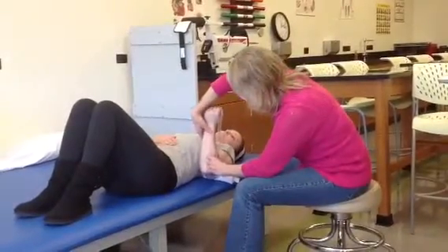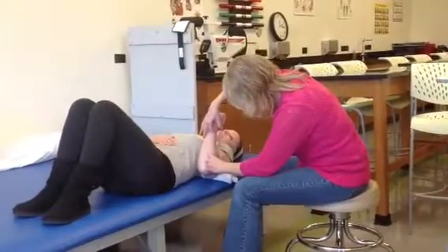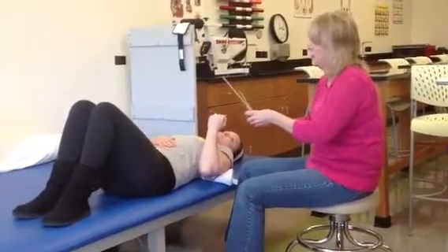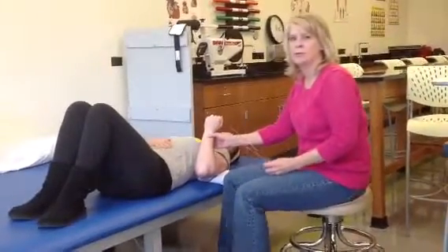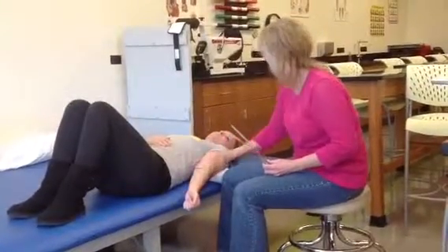and so we're just going to go ahead and take a hold of her arm and just move it down a little bit more to where she is, about right there, and move it down. And at this point, she's at about 130. So we'll just count that as her range of motion when she is doing her treatments later on.